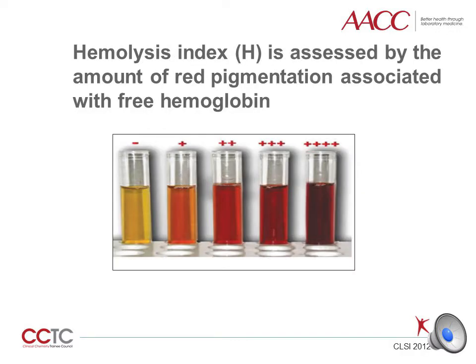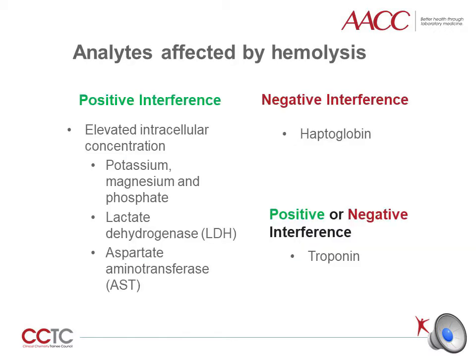Hemolysis index is assessed by the amount of red pigmentation associated with free hemoglobin. Upon damage to the cell membrane, hemoglobin and other intracellular components from erythrocytes are released into the extracellular space of blood. Here is a list of analytes that are commonly affected by hemolysis in the lab. Release of analytes found in high concentration in red blood cells will be falsely elevated. Examples include potassium, magnesium, phosphate, LDH, and AST. Hemoglobin binds to haptoglobin, therefore haptoglobin exhibits a negative interference on the measured haptoglobin concentration.